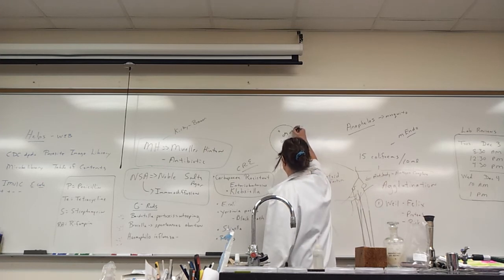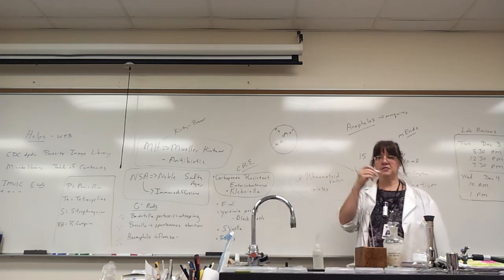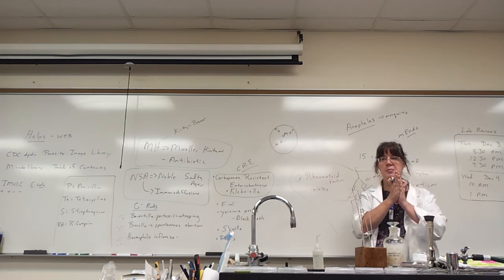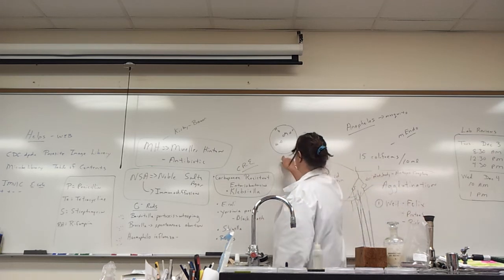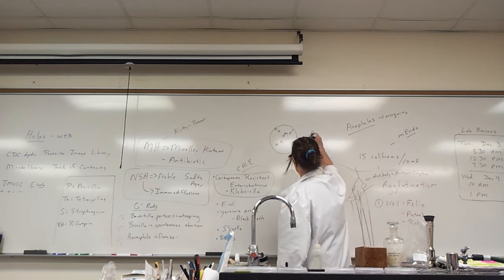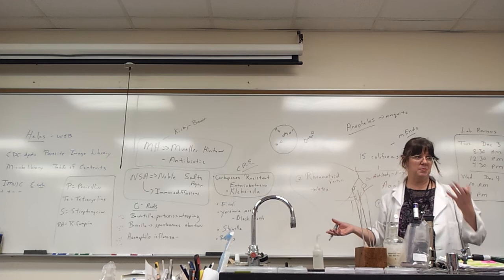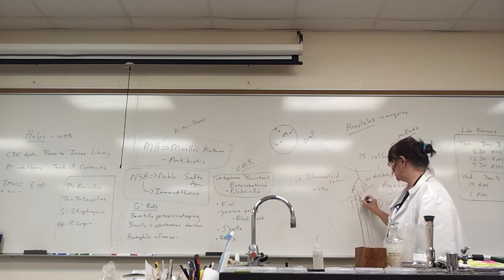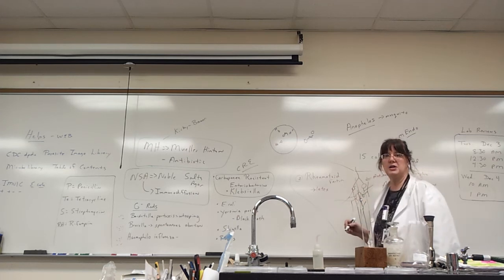You put the antigen in the center, put antibodies on the outside. They're always like a matched pair. Get one and they match, you're going to get the other one. As soon as you have those wells and you load them, the antibody and antigen start diffusing out. So it's called immunodiffusion: immuno for the immune system, antibodies, and diffusion for diffusion. You want to form this lattice work, the antibody antigen complex.